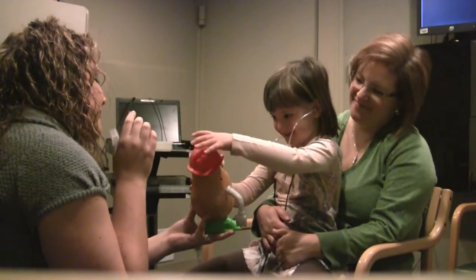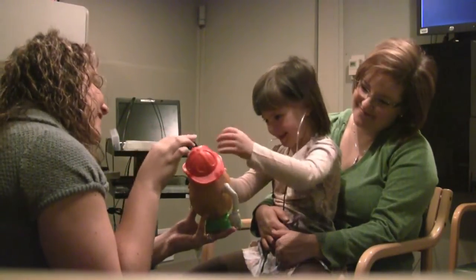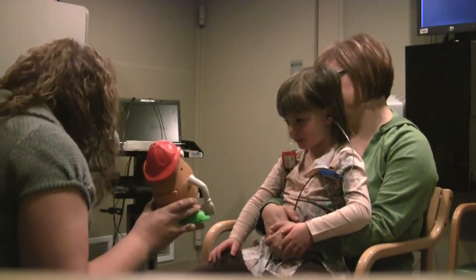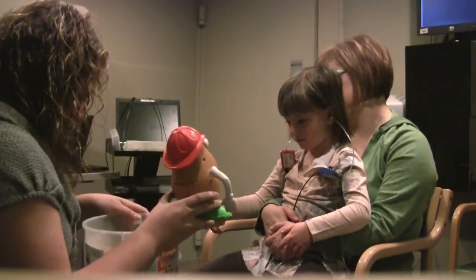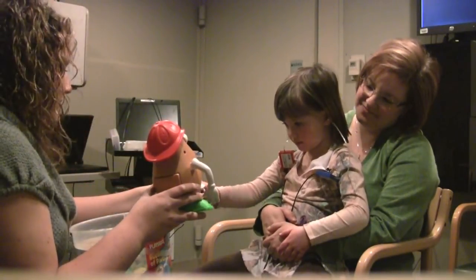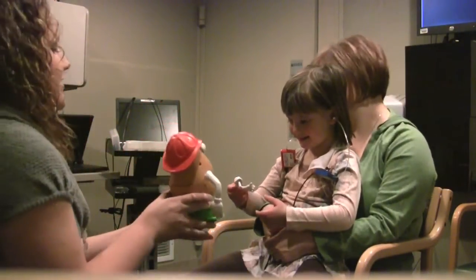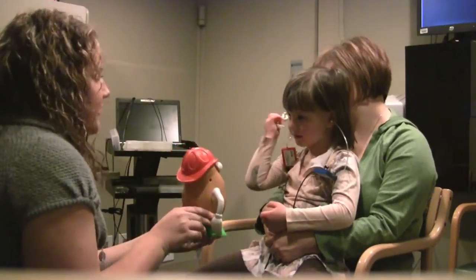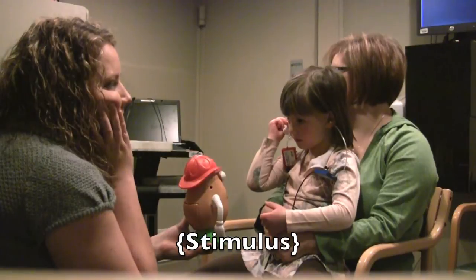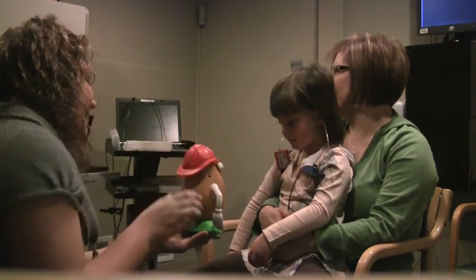This is going to be a pretty cool looking potato head. To condition the child, begin by explaining the task using simple instructions. Then demonstrate what is expected of the child. This is done by presenting the stimulus at an intensity level the child is likely to hear while holding the child's hand with the object in it up to his or her ear. Immediately after the stimulus, move the child's hand away from his or her ear and towards the appropriate response while providing instructions and positive feedback. This is continued until the child can respond on his or her own.